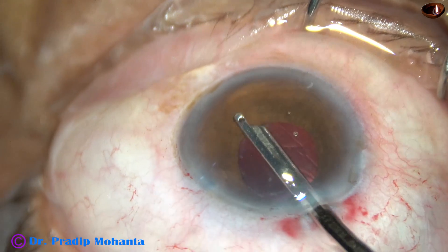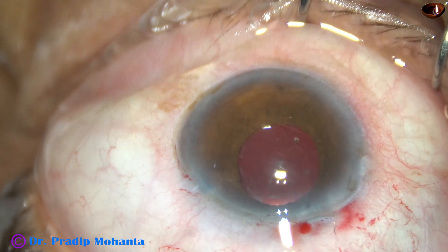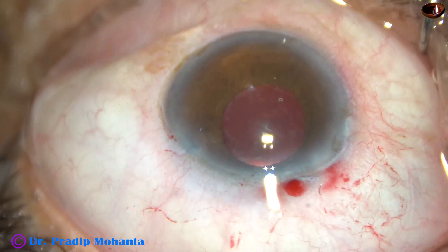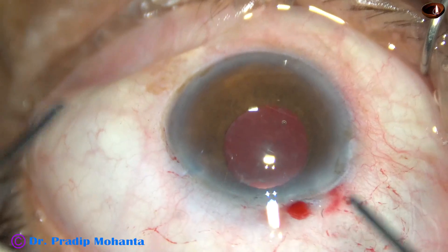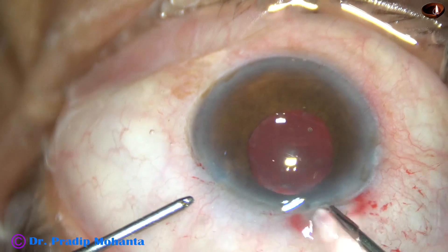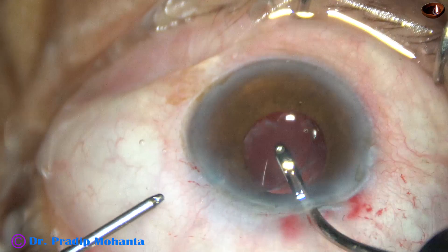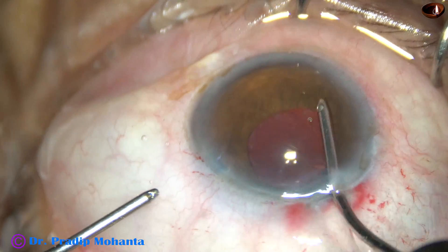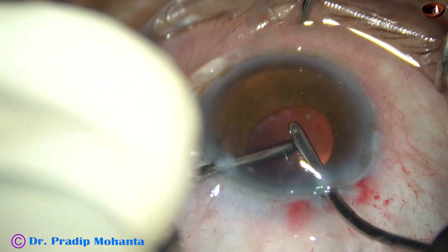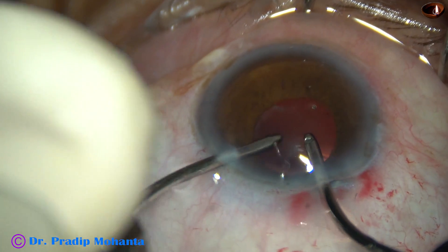And now I am going to remove all the visco. Visco must be removed very nicely because otherwise there can be visco-induced raised intraocular pressure, which is very uncomfortable for the patient. Once the intraocular pressure goes up there is corneal edema, steamy corneal edema — there is pain and the patient is not happy. So we must devote some quality time to remove the visco.